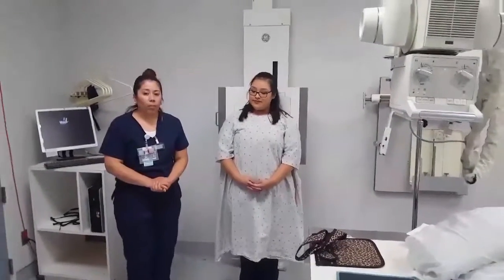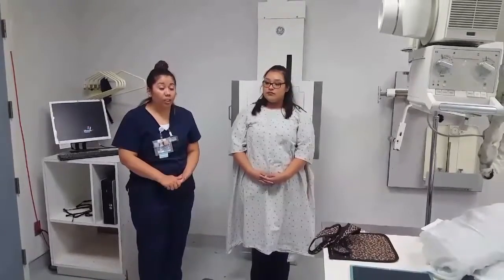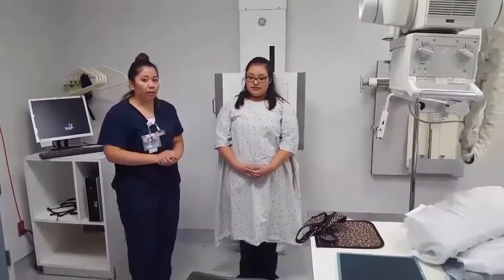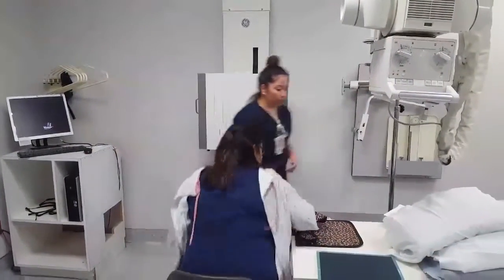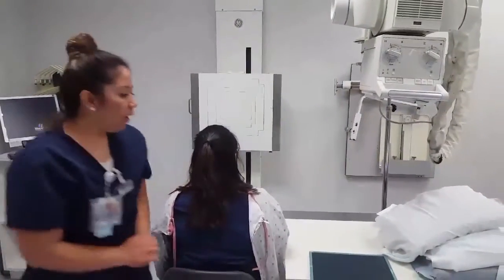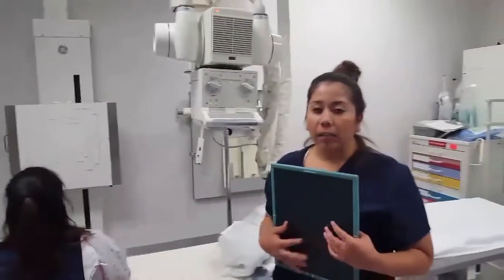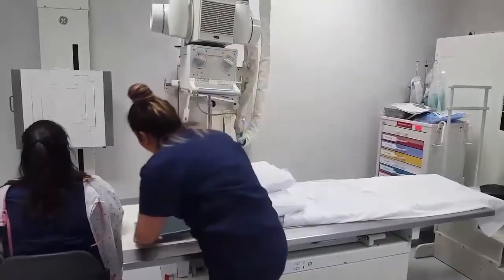So for our final projection, we're going to be doing our superior inferior axial projection. And we're going to have our patient have a seat on the chair. So Ms. Garcia, if you could go ahead and sit down. Next, I will be placing a shield on her lap. So you could go ahead and hold that there. Also, I'm using a 10 by 12 IR, and also my console has changed to tabletop. So I'm going to place that here.